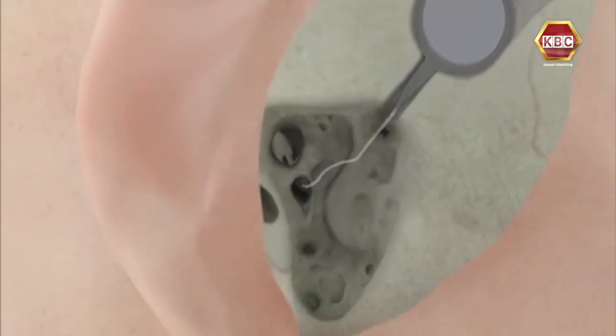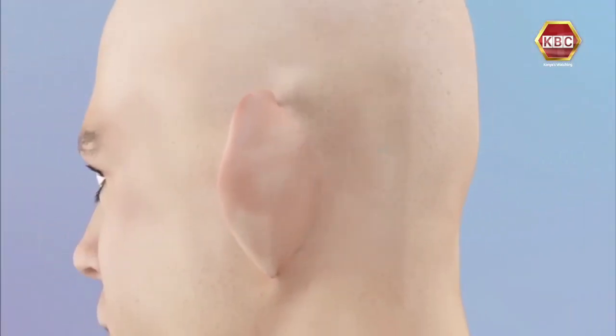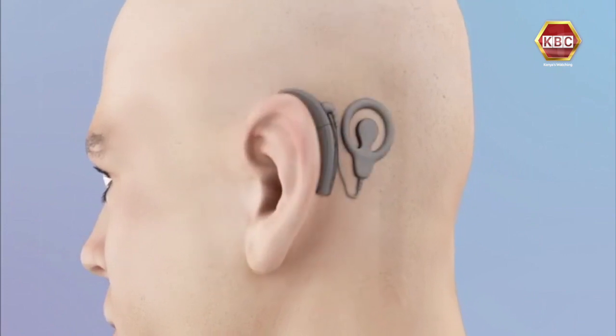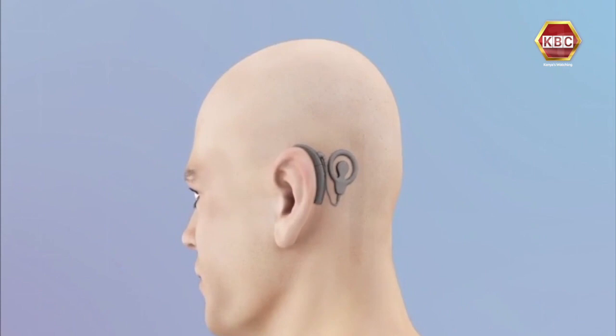Once the team of specialists has given the okay to proceed, the surgery is now done and the cochlear device is implanted. This team of surgeons will decide and say, well, if we do a cochlear implant for this person or for this baby, the chances of success is 90%, 80%, or such a percentage, and therefore we can go ahead and do the surgery.